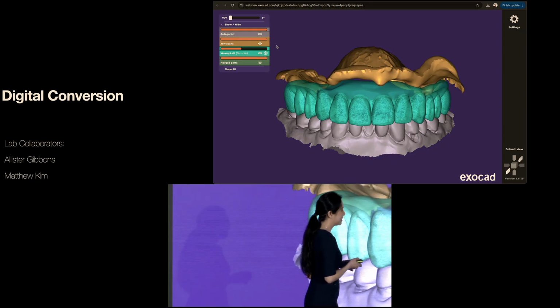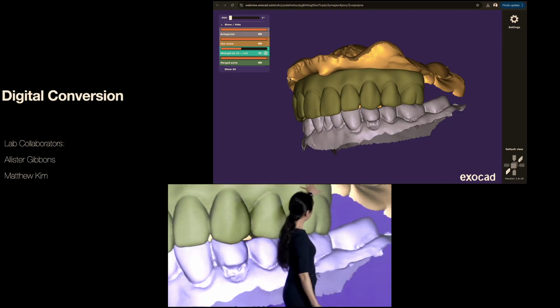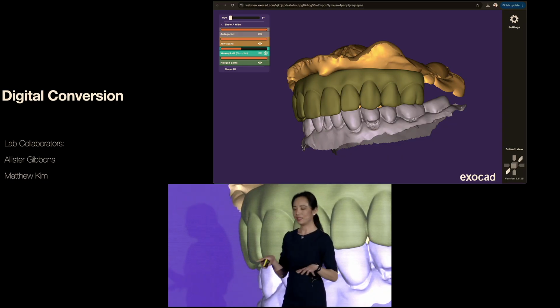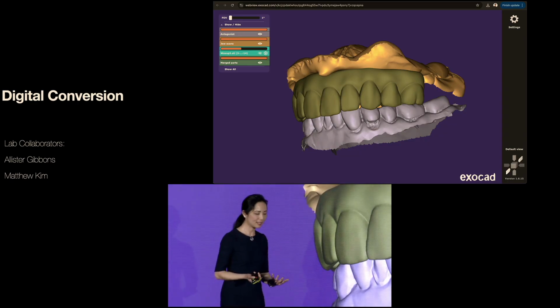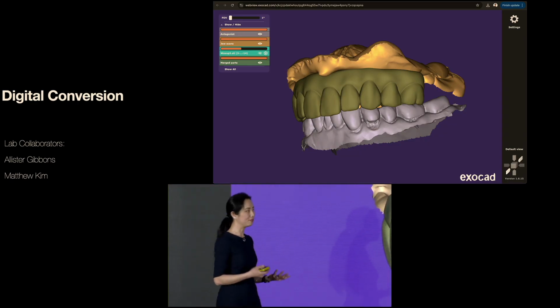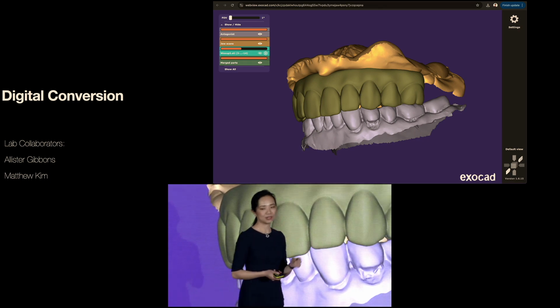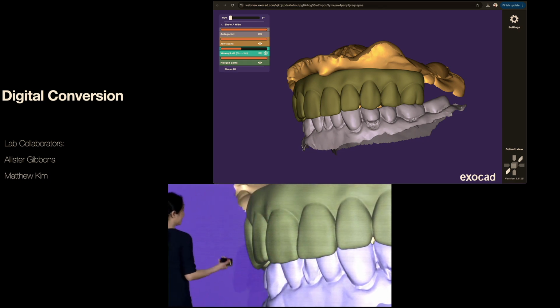If you haven't experienced it, what happens is that sometimes when we do a conversion, we're hardwired to try to connect all the implants and make the intaglio flat or convex. The problem is that sometimes it'll interfere with the ability for the tissue to go through sufficient or passive healing around it. So if you put excess pressure on it, what happens? Sometimes nothing, sometimes bad things.